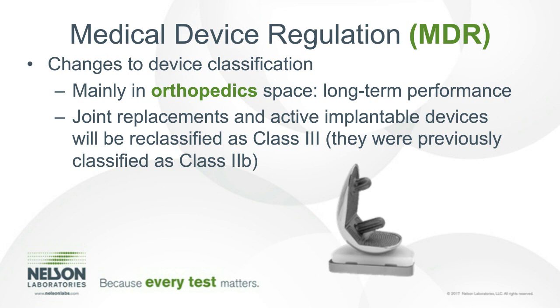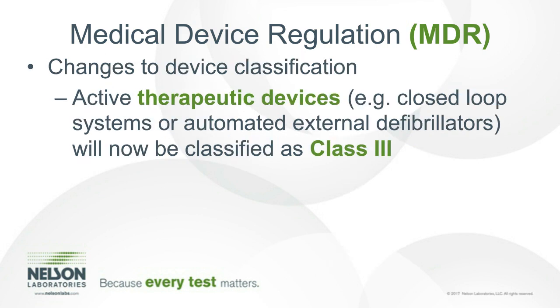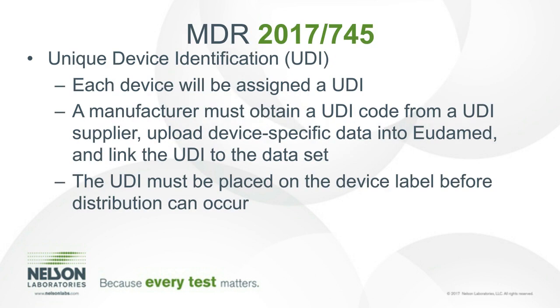There are also changes in classification regarding active therapeutic devices. Closed-loop systems or automated external defibrillators will be classified as Class 3 as well.